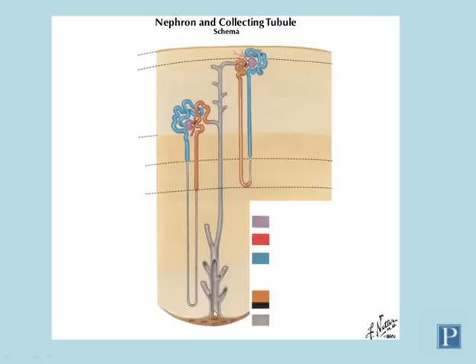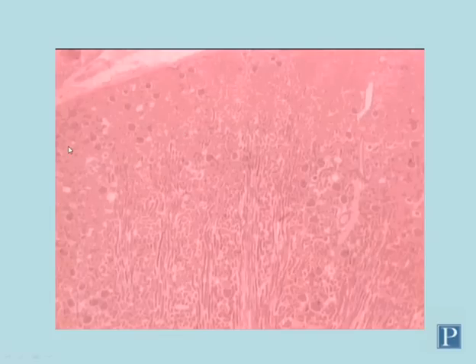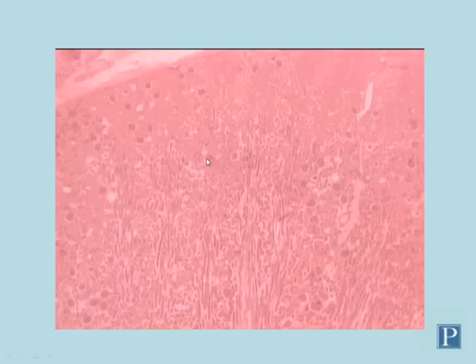Those are the important structures of the nephron that you need to know. Let's take a look at these structures in actual histological preparations. Here's a low magnification view of the kidney. Here's the outer portion — the cortex. You can identify the cortex because of the presence of these renal corpuscles. You can also see parts of the medulla, known as medullary rays, which extend up into the cortex and are composed mostly of collecting ducts. Here's a slightly higher magnification view of the cortex, where again you can see the renal corpuscles.